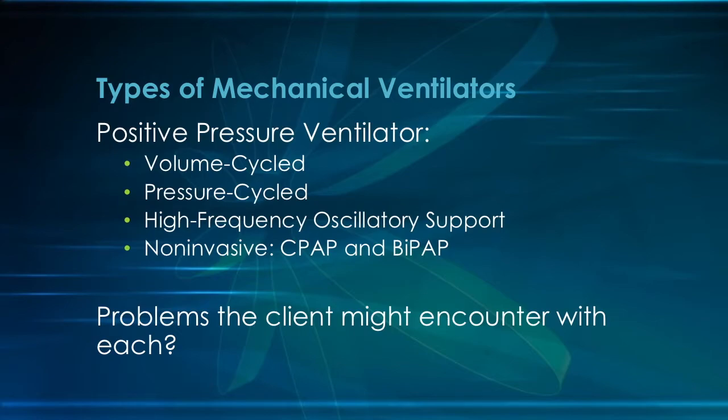It's really like a large machine, and it does a lot of vibrating. If you compare it to the chest vests, the machines that break up all the mucus for our CF patients, it's almost like that, except it's constantly pushing pressure into the thoracic cage. But the problem with this is if we have too much pressure in that cage, we can cause things like barotrauma, and that's never a good thing.